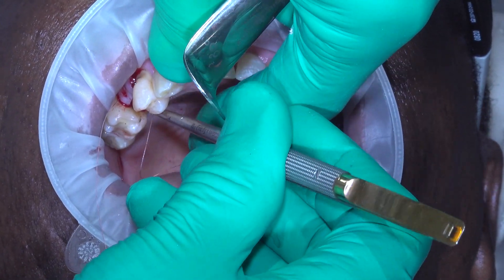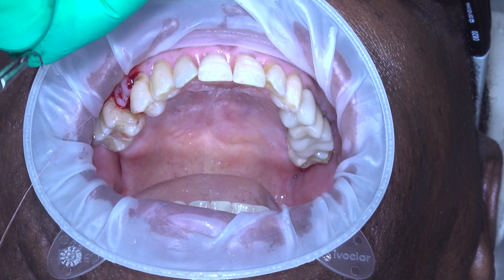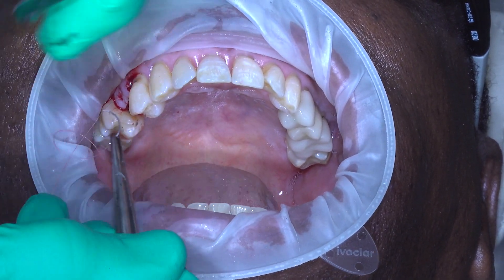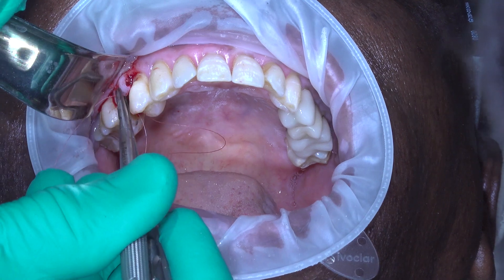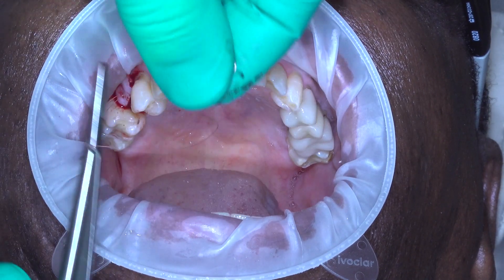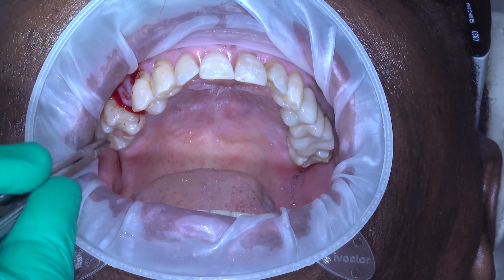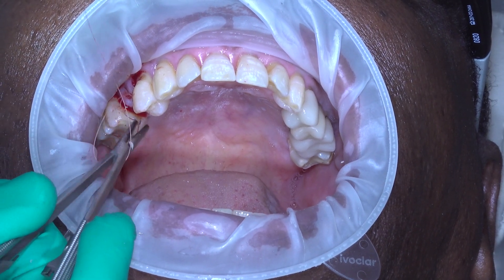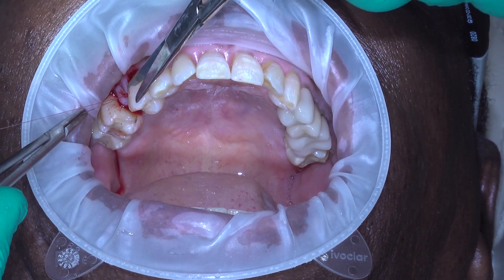I've taken a bite on the lingual twice — that's the second bite there on the lingual. Now we're passing it back on the mesial towards the facial, and we're going to make our last bite starting from the palatal side of the tissue, the periosteum side, and come through the facial. My assistant's using cotton pliers instead of tissue pickups — that always makes me happy. We're going to take our suture and tie it off with a normal horizontal mattress. This is only necessary for the AGD technique when that facial tissue is floppy. Because it was elevated down into the mucosa, it became loose, so I said let's put a little suture in here just to help hold it in place.